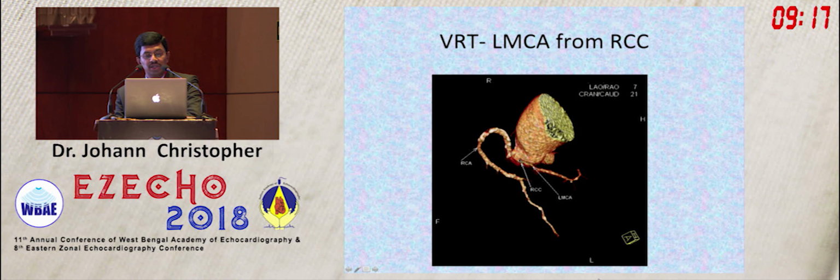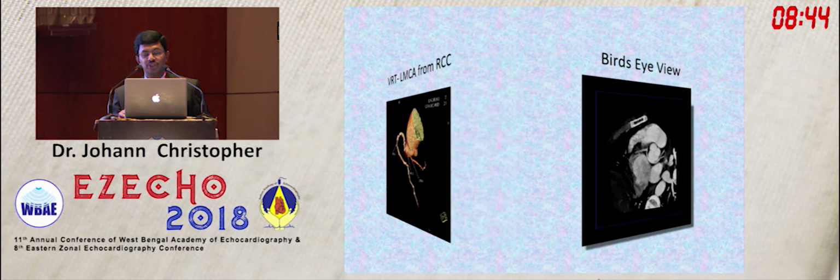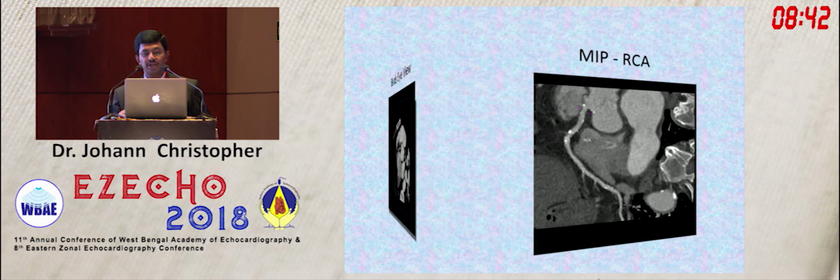It actually passes along the fibrous cusp of the valve and has almost an intraseptal course, compared to if this particular vessel had a higher up course and was actually coming between the muscular portion of the two vessels. And in our series of 12, it's a small number, we found that if the origin is lower down, it seems to have a sparing effect on the vessel. And the MIBIs are actually negative. And these patients now have almost a 1 to 2 year follow-up, which we have just published, just on beta blocker, despite the so-called malignant course.